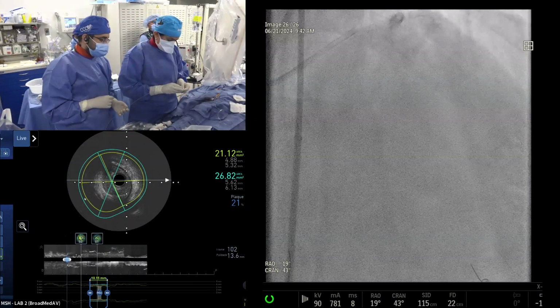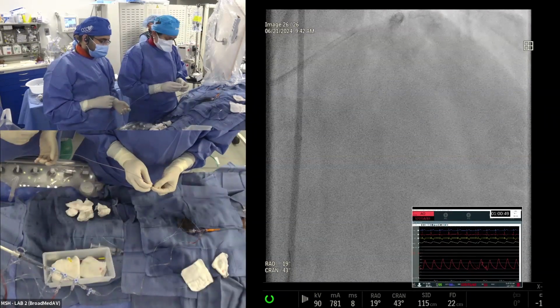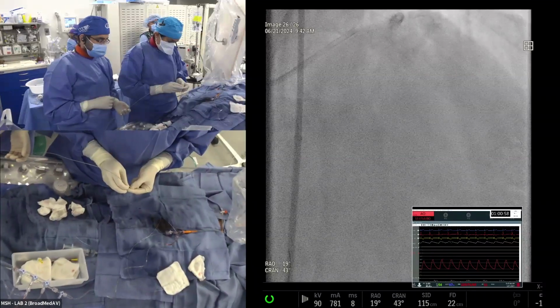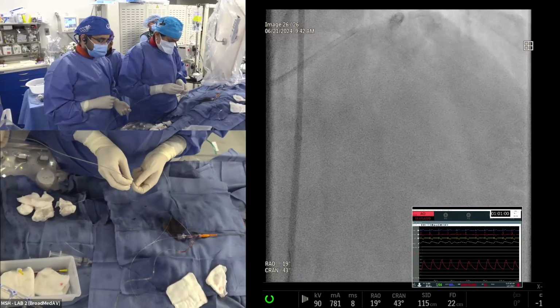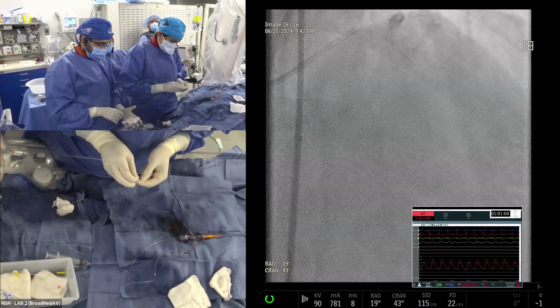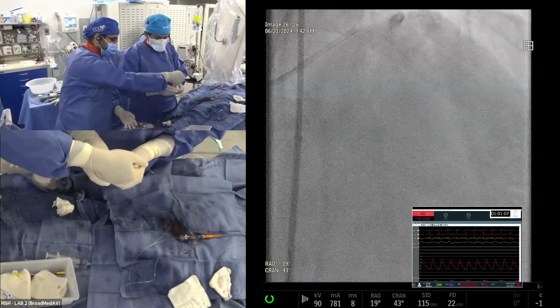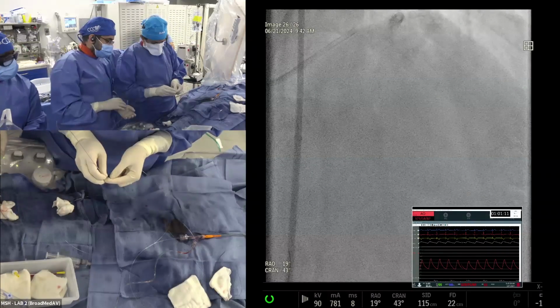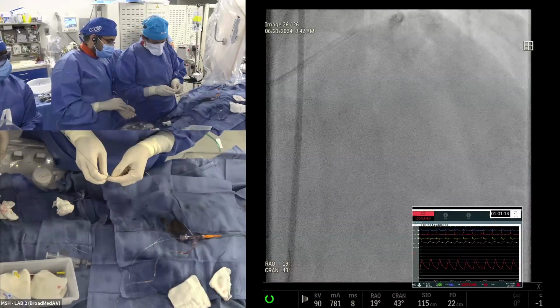The only thing is the concept which has been prevailing, that cutting balloon before rotablation may give you better lumen compared to high pressure balloon, we could not substantiate. There was no difference, and of course we are going to follow those patients for 1 year, although a small number, 60 patients, to see if there is any difference in TLR, which I doubt, because none of the major trials have shown that rotational atherectomy will decrease your TLR. So acutely they were fine, no extra complication or actual benefit.